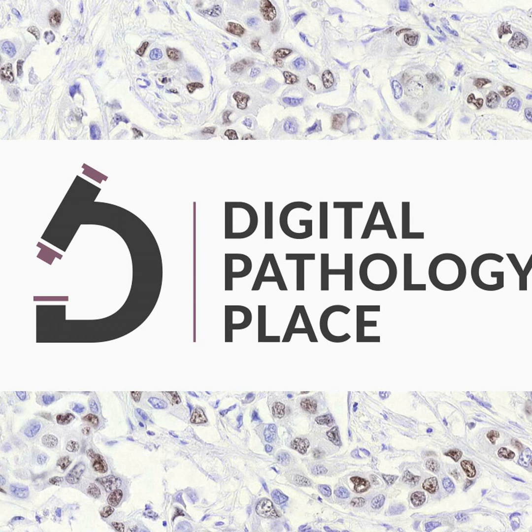So that is where we try to emphasize and have had a separate team to try and have high performance computing on productizing the AI algorithms, so that it's at least reasonable in terms of the time it takes for a pathologist to expect an output and those type of things. That itself can take a significant amount of time and resources as well.